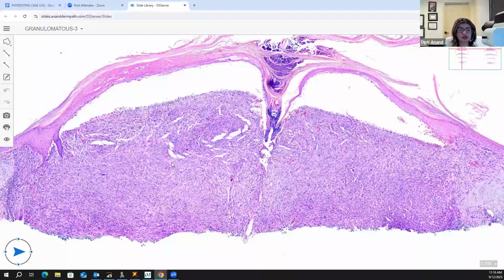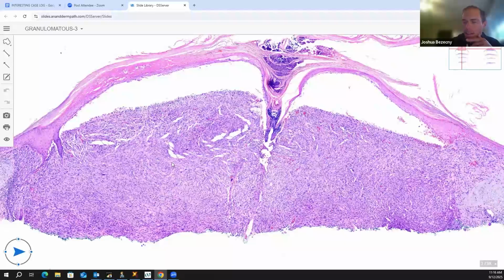The question is, they will show you this slide. Now they're going to ask you second order questions. So the answer is not going to be recognizing an AFX, but a second order question associated with it, which is classic for your core exams, right? So the second order question is, it's a 70-year-old man with this lesion on the scalp. This is the histology. On excision of this lesion, you find perineural invasion and invasion into the fat. The lesion now is best classified as DASH. Oh, okay, gotcha. I didn't understand the DASH part.